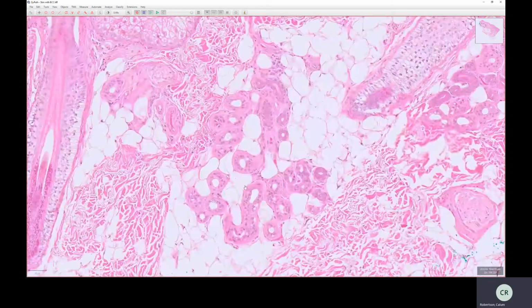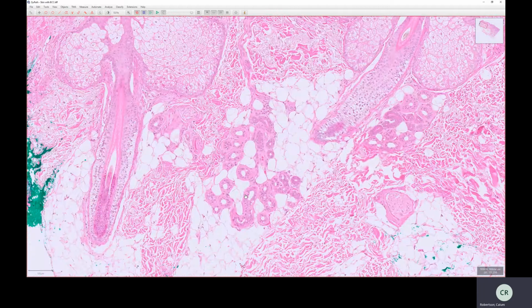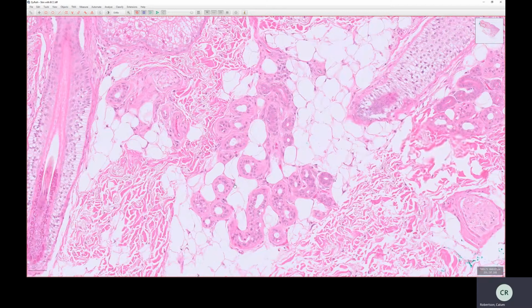And they look like a lot of little glands, but actually they're all connected in this one big coil, because remember, this is a two-dimensional section through a three-dimensional structure. So this tube would come out towards us and curl back around and then go back in here and then out here and in here and so on and so forth. So it's a coiled structure, and these are eccrine sweat glands, as opposed to apocrine sweat glands.